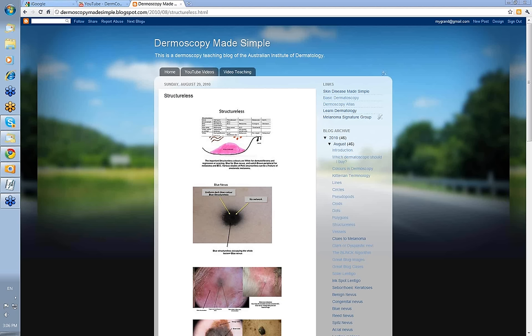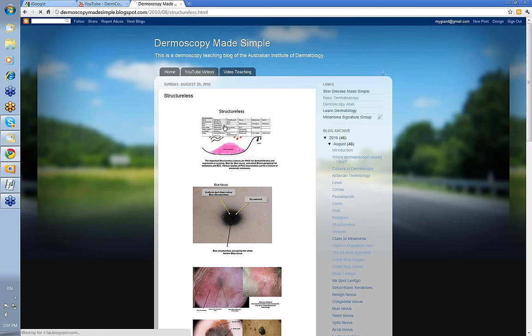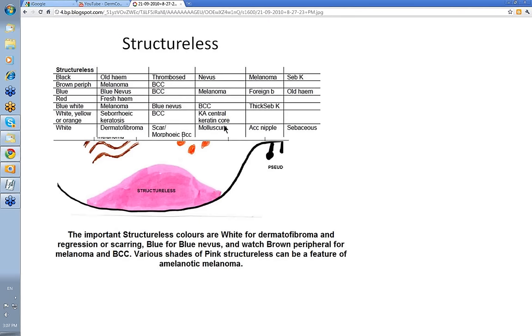Structureless is the least specific of the various elements in the Kittlerian diagnosis — it's the one with the greatest range of differential diagnoses. Let's just have a little look at them.